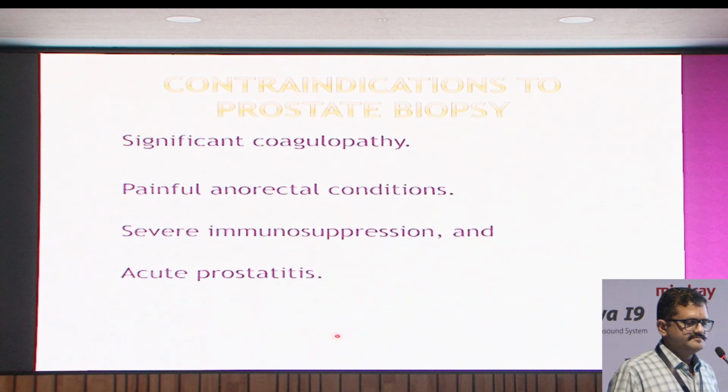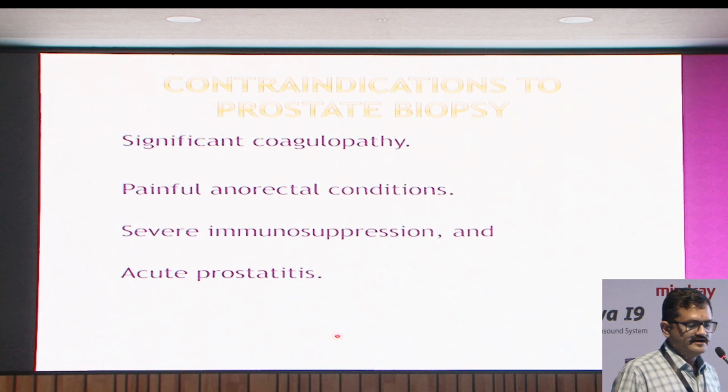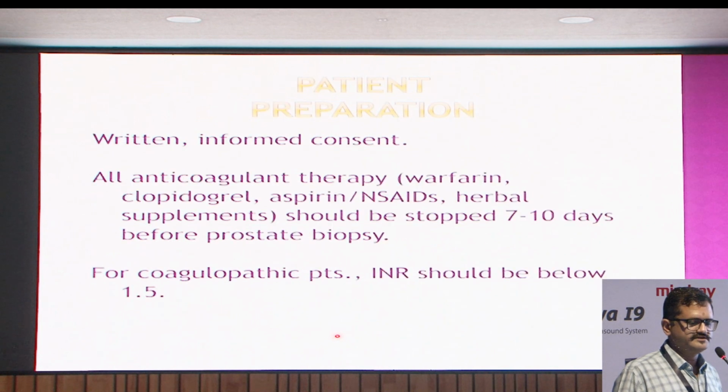Contraindications for prostate biopsy are significant coagulopathy, painful anorectal conditions, severe immunosuppression and acute prostatitis. Before going to the procedure, written informed consent should be taken. All anticoagulant therapy should be stopped at least 7 days before the procedure, and the INR should be below 1.5.